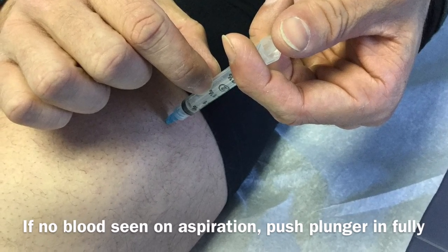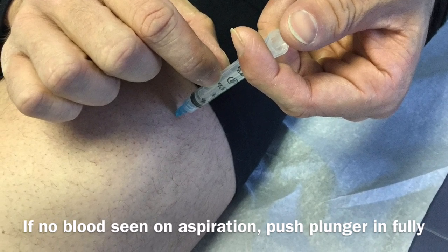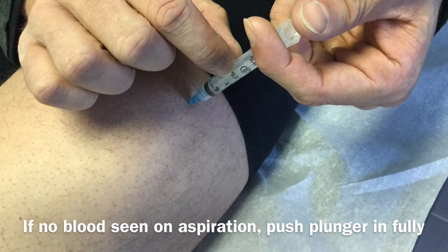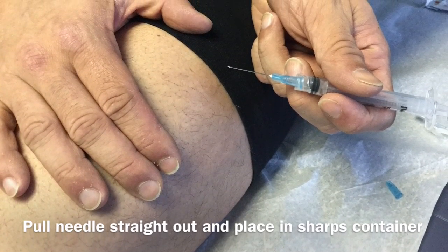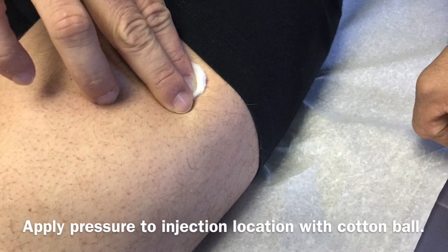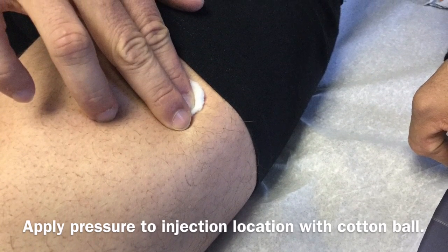Then, after aspirating, you'll go ahead and press the plunger firmly until all the medication is injected into the muscle. This may be done pretty quickly, or you can do it slowly if you'd like. Go ahead and remove the needle, take it straight out of the skin, place the needle in the sharps container, and then apply a little pressure with a cotton ball and massage the area, which should decrease any pain or tenderness afterward.